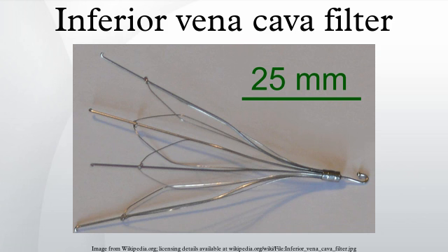indications. These are usually very controversial reasons to do an IVC filter, and most radiologists and doctors generally will not recommend an IVC filter if other options are available instead.